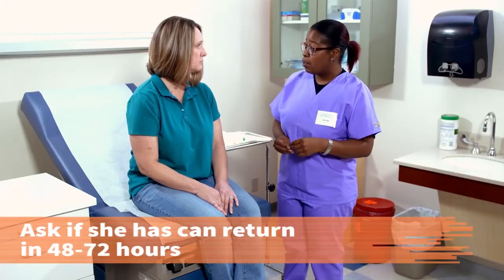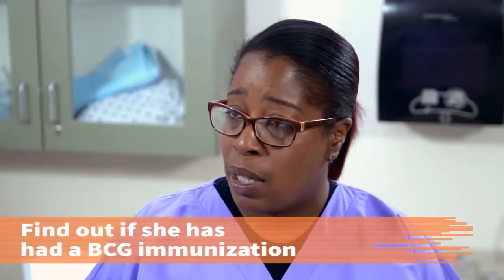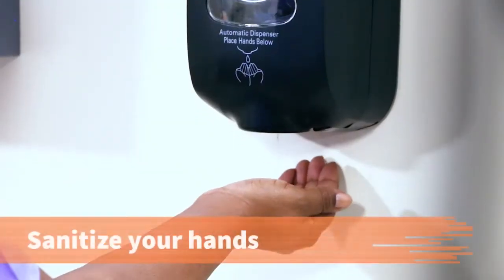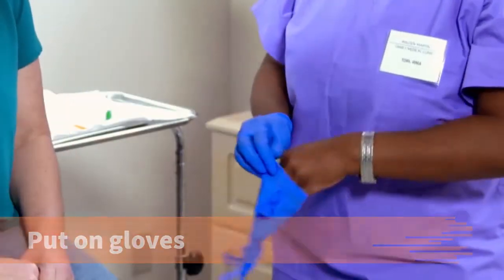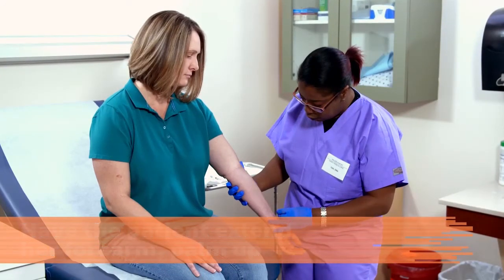Ask the patient if she can return in 48 to 72 hours for the reading. And will you be able to return in 2 to 3 days to have this read? Yes. Then find out if she has ever had a BCG immunization. Sanitize your hands again and put on gloves. Have the patient extend a forearm with the palm facing upward.